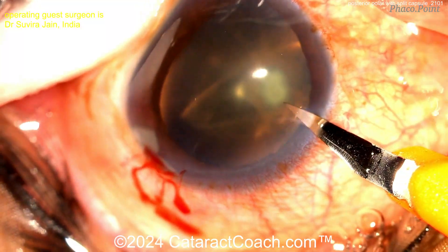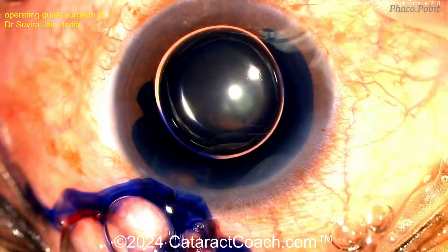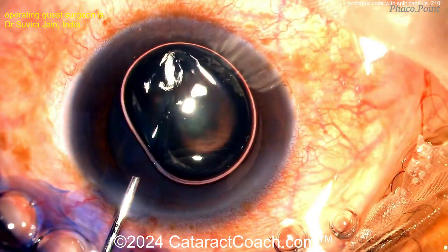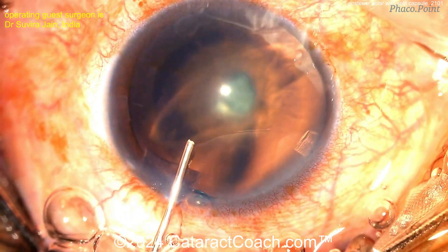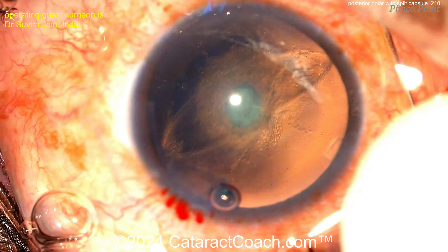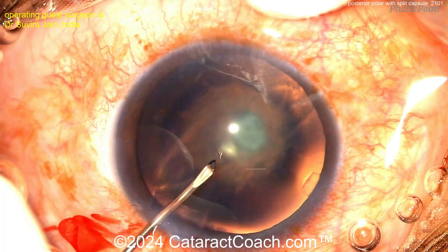Starting with the incisions, you can see there's the posterior polar opacity and the capsule is definitely split down the middle. There's a little bit of trypan blue dye here with an air bubble to get some anterior capsule staining. Put viscoelastic in, and remember you need a nice capsulorrhexis here because you're probably going to end up doing a three-piece lens with optic capture. So let's get a five millimeter rhexis. There's that posterior polar opacity and you can see how the capsule is split wide open — that's the elliptical shape there.